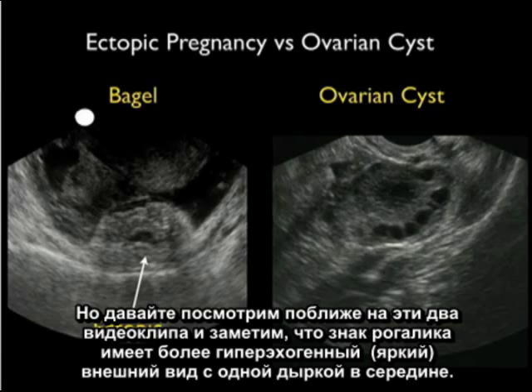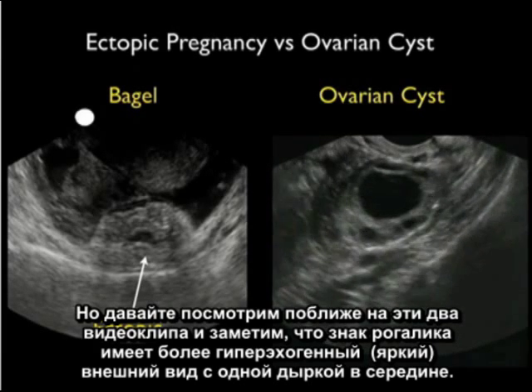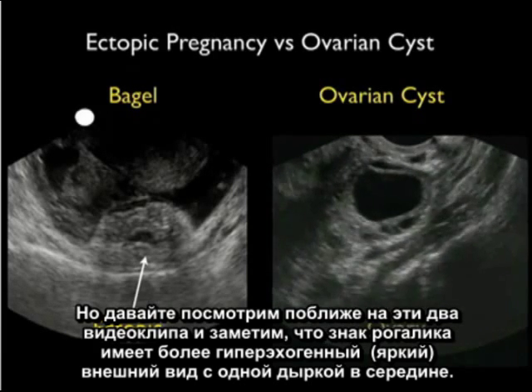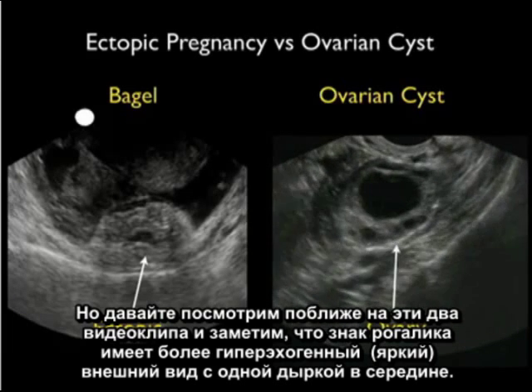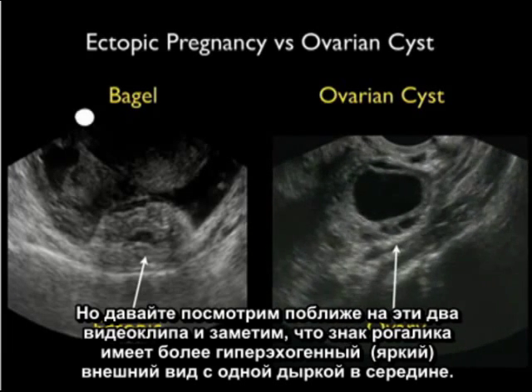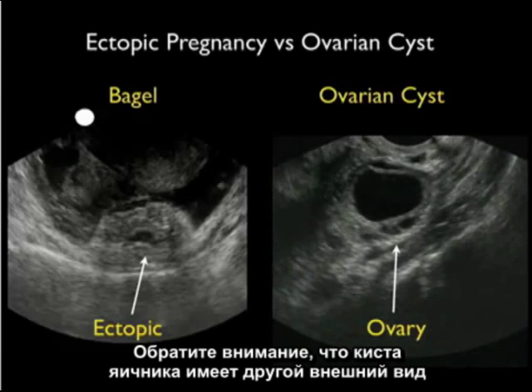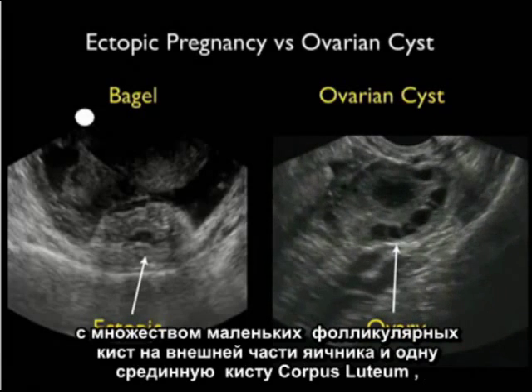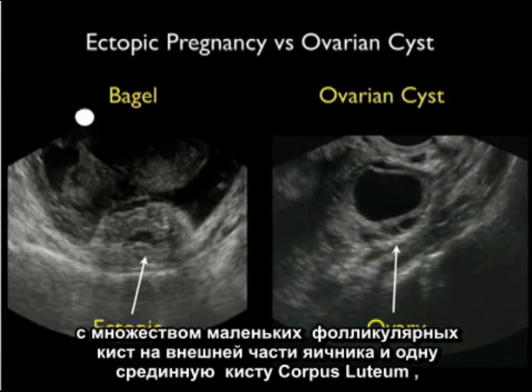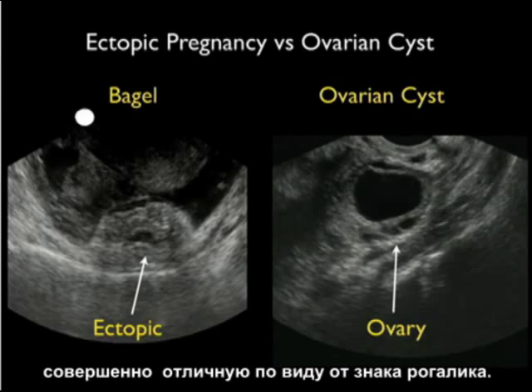Looking closer at the two video clips, notice that the bagel sign has a more hyperechoic or brighter appearance with a single hole in the middle. The ovarian cyst has a different appearance with multiple small follicular cysts to the outer portion of the ovary and a single midline corpus luteum cyst — very different than the bagel sign.